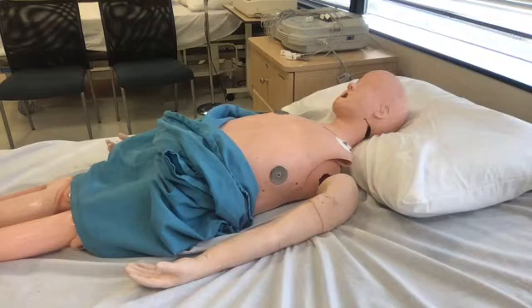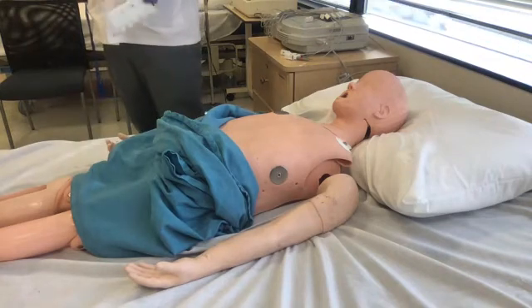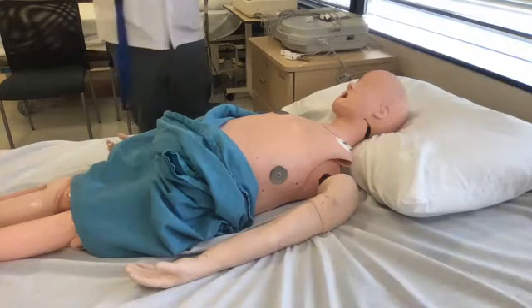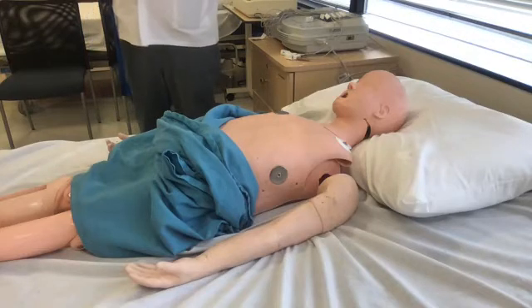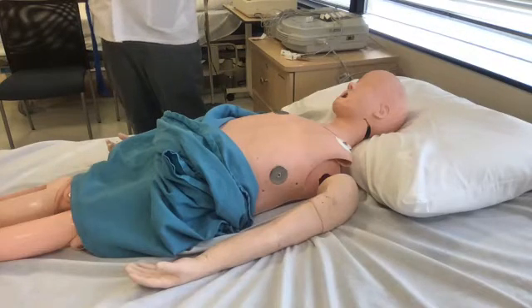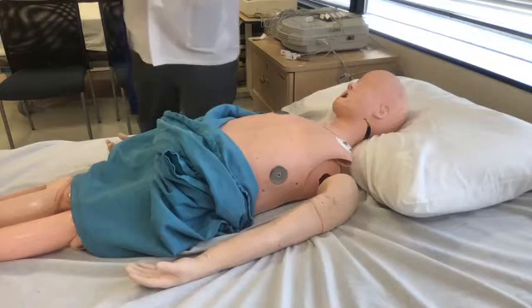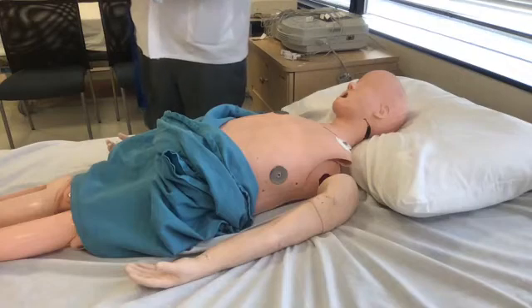Now, what are we going to use? We're going to use these. These are electrodes. These are like middle-of-the-road electrodes. I like 3M Golds. They're like 10 times more expensive than these bad boys. But, oh man, these are better than the cheap training ones. Now, gold is a wonderful, wonderful conductor of electricity. But again, I'll reassure your patient that we're detecting the electricity of your heart, and it's very, very small. And this should be painless.